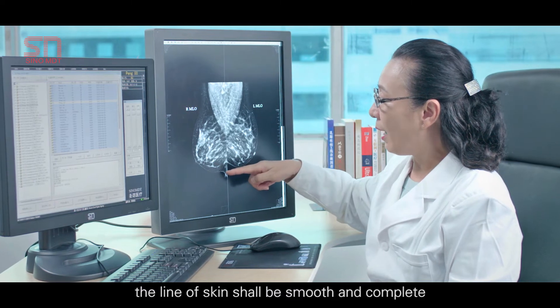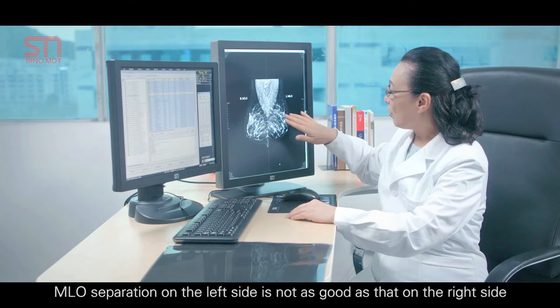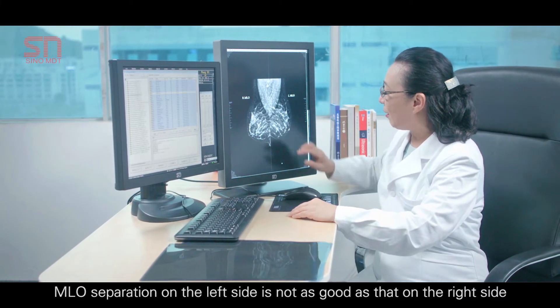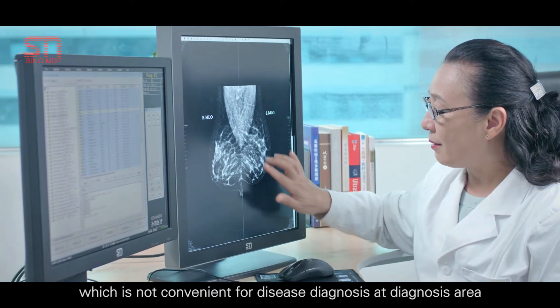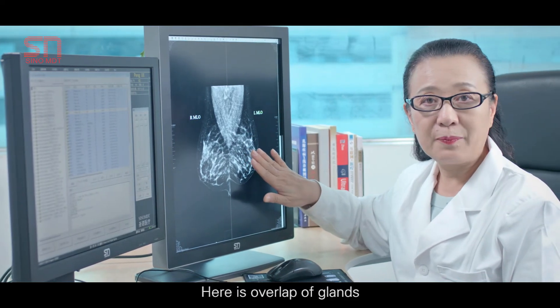The line of skin shall be smooth and complete. The papilla shall be on the tangent line. The MLO separation on the left side is not as good as that on the right side — there is a feeling of dropping, which is not convenient for disease diagnosis in that area. Here there is overlap of glands.